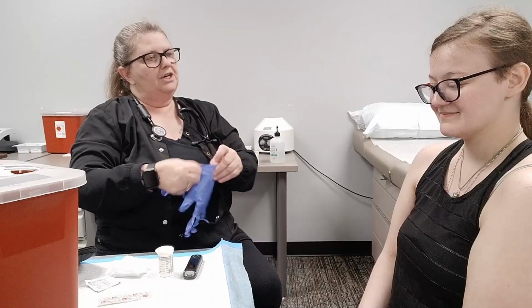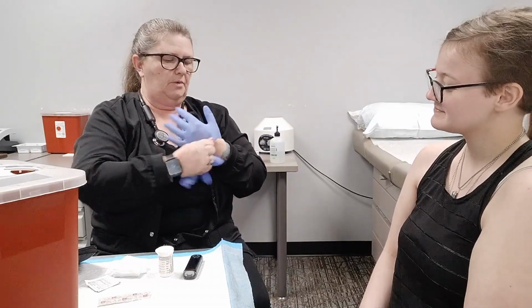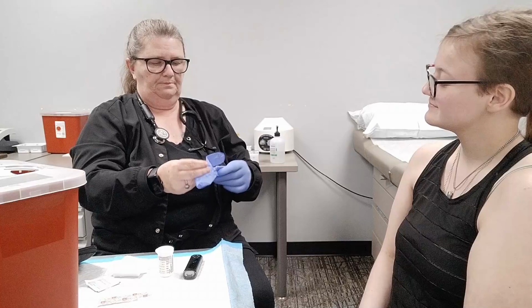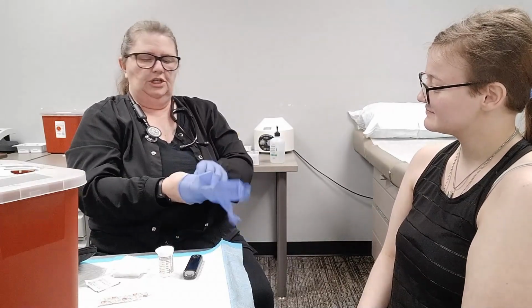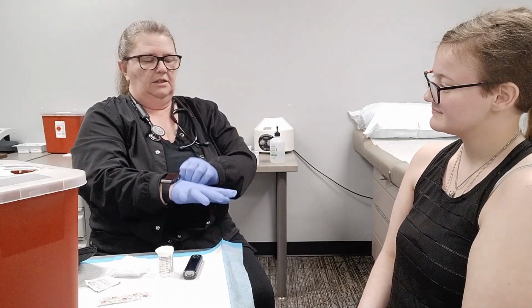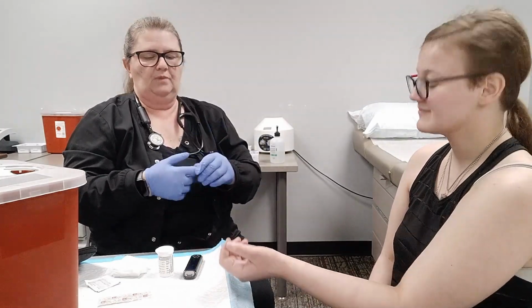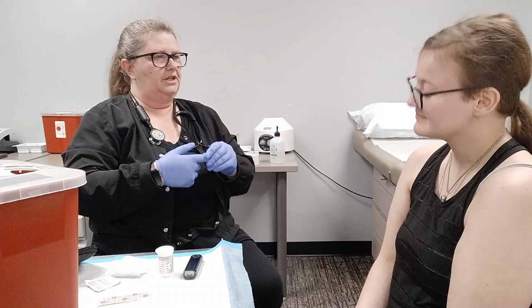Get some gloves here. Have you ever had this done before, ma'am? I have not. Okay, so basically what we're going to do is check the level of glucose, or sugar, in your blood. And we're just going to do that by a small little stick of the finger. Get a little blood out. We're going to put it in this machine and it'll tell us what that reading is.